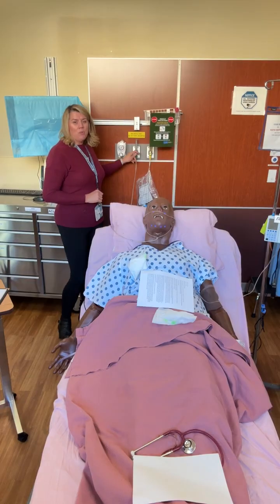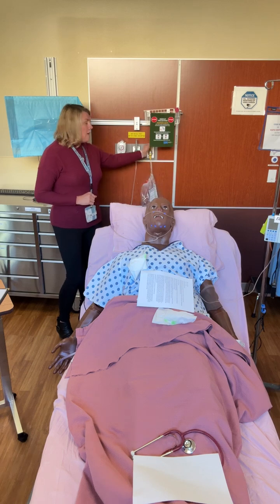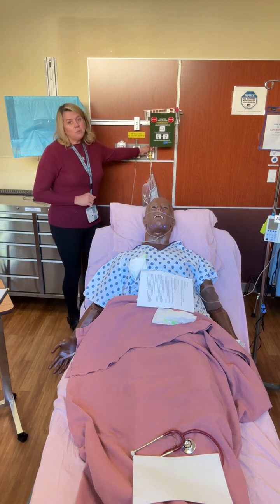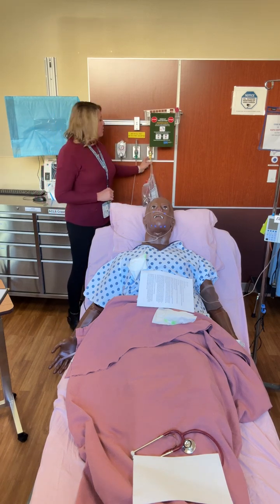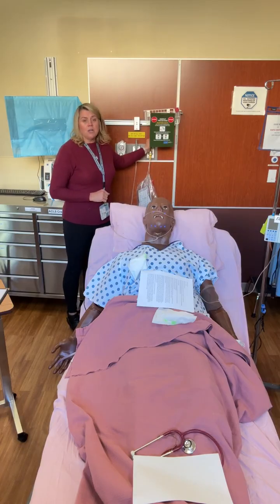It is not an open type of system. You have to follow doctor's orders for oxygen. And then you have your air flow meter, and that is what you're going to give a nebulizer with. And when you hook up your nebulizer to it, you're going to hook it up to 8 because that's great.